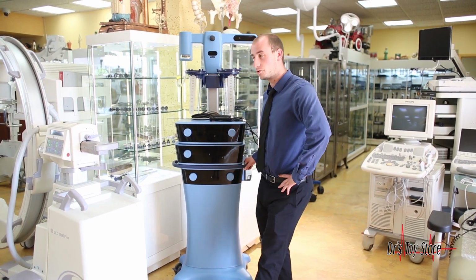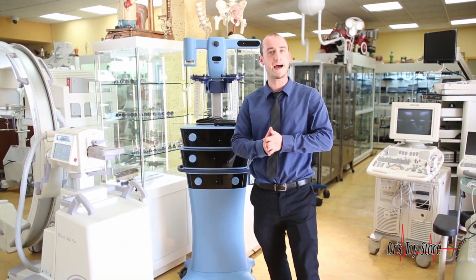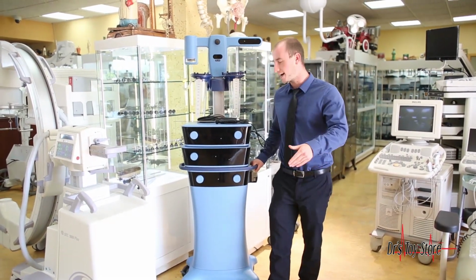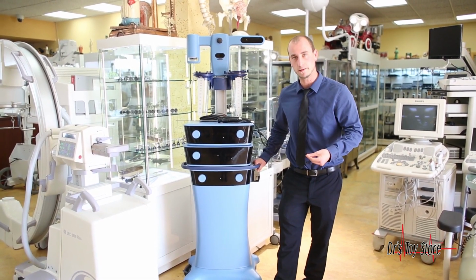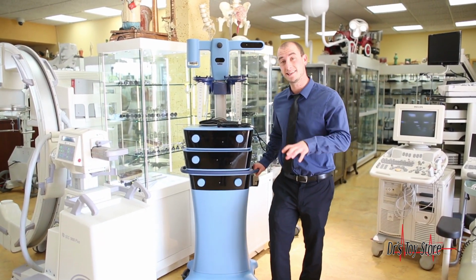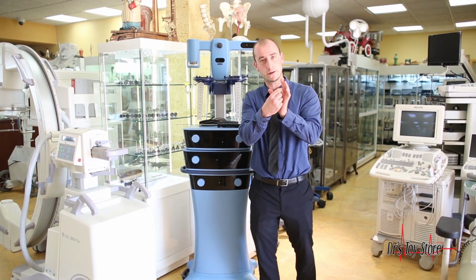Well, we found out through research that it's not from bone marrow, it's not from teeth, it's actually from adipose tissue, which is essentially fat tissue in the body. So what you have here is the VASER. This is the best way to actually get viable stem cells from the fatty tissue from the body, because you emulsify the fat before suctioning out, making sure that all the stem cells are actually intact and not destroyed. So you have the fat, and then you have the stem cells inside the fatty cells.